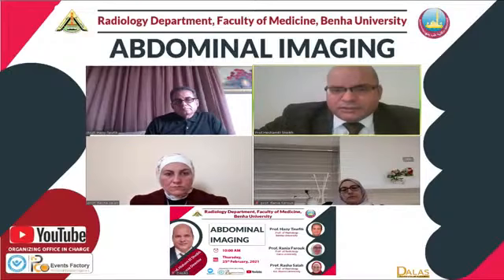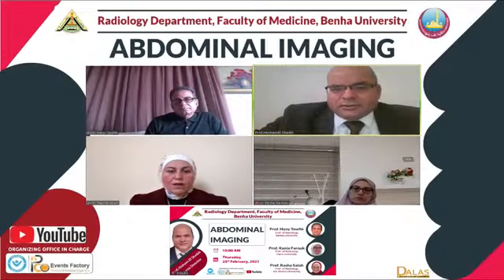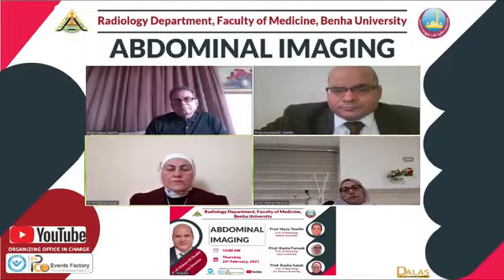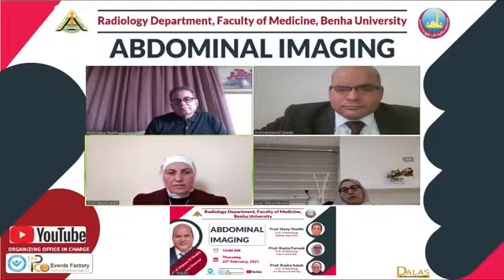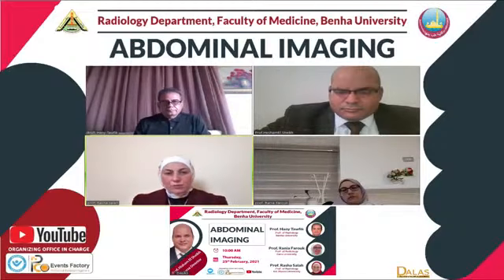الديفيوجن في الام ار في الاول خالص دكتوره رشا، هل ليه added value يعني في الكيسز حضرتك ما كانش فيه؟ الديفيوجن is very helpful لما بنحطه في الانيشال staging، بيبقى helpful لما بنيجي نتابع بعد كده هل الديجري بتاعت الريستريكشن ما زالت لسه موجوده، لان الديفيوجن هو بيعتمد على الجريدينتس وبيبقى susceptible لارتفاكتس كتيره، اهمهم الاير انسايد ذا ريكتال وول والموتيليتي بتعمل ارتفاكت. فمشكله الديفيوجن ان هو بيبقى susceptible for artifacts اكتر من اي سيكونس تاني في الام ار اي.